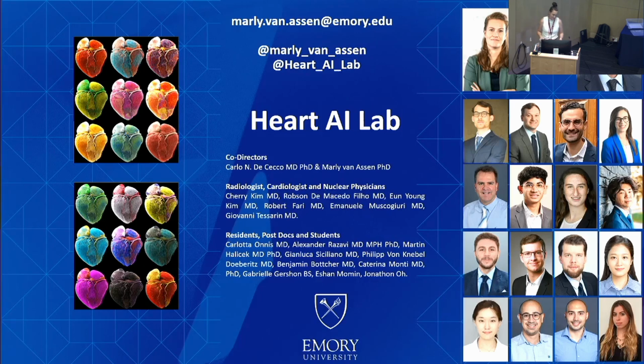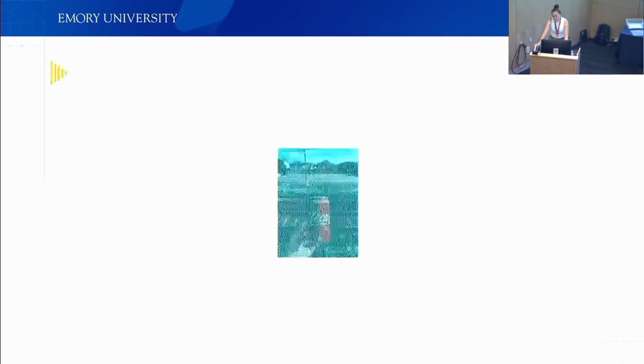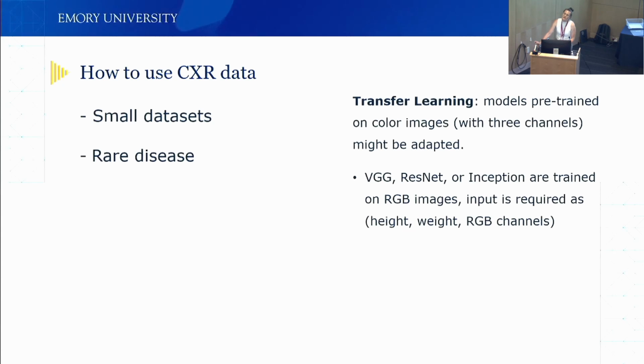When you are describing the acute patients, if there are 5 patients and one of them is really urgent, what stratifies the one that's most urgent? Is it the clinical diagnosis? Is it somebody on the front end saying, hey, this patient needs to be moved up, or is it something in there? So the algorithm.